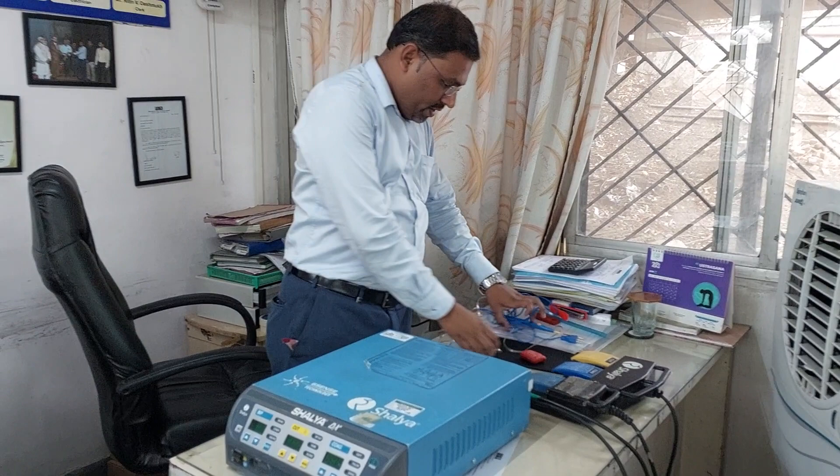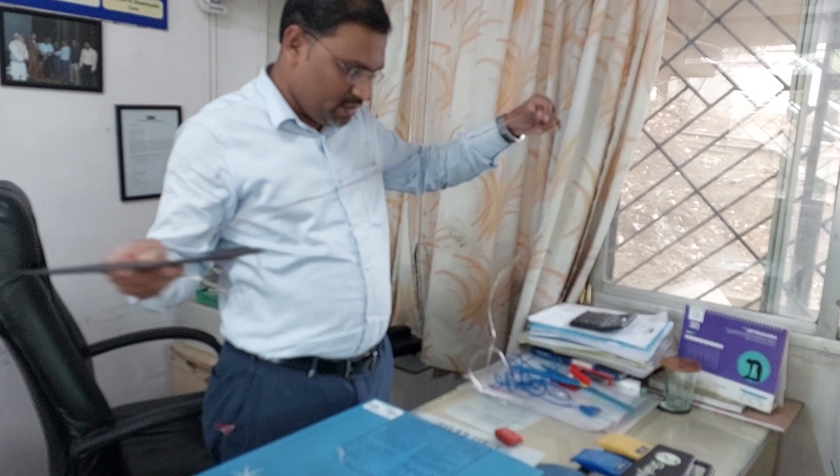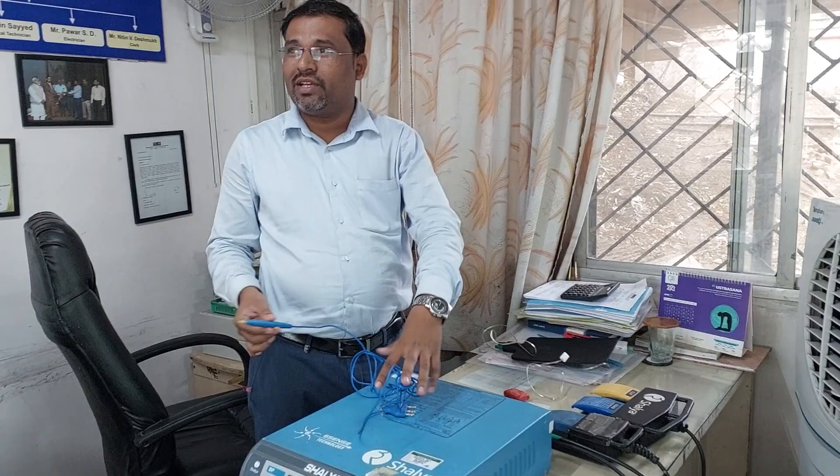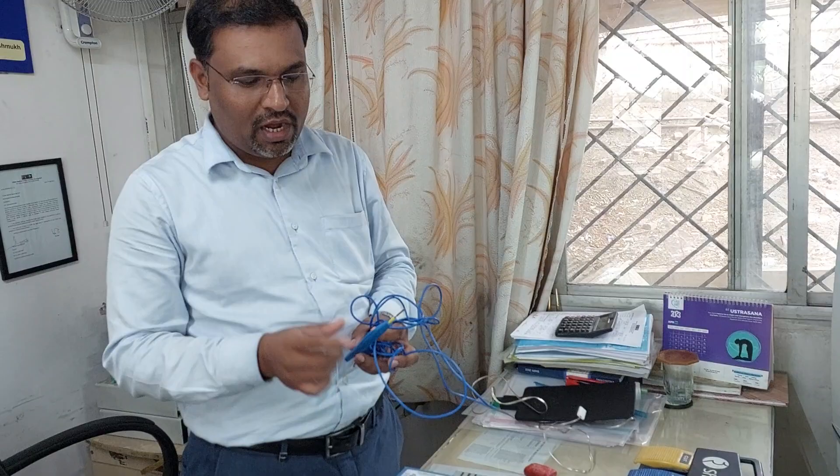Very importantly, with the cautery machine they have provided what is called a patient plate, which is always placed below the patient. This is your cautery pencil. There are two types of cautery forceps — monopolar and bipolar.